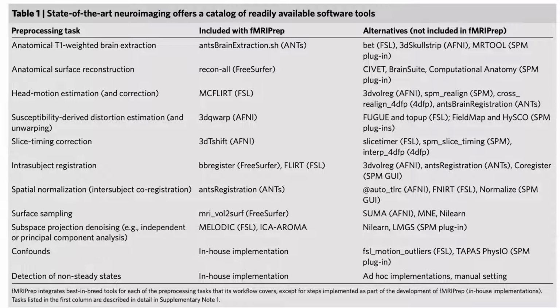And the main idea or benefit of it is that it's relatively automatic, such that you don't have to write a new script for each next project. Because the information is all in the JSON files from the BIDS format, you literally need a single line of code, like fMRIPrep subject 1, pretty much, to run the pre-processing for that subject.